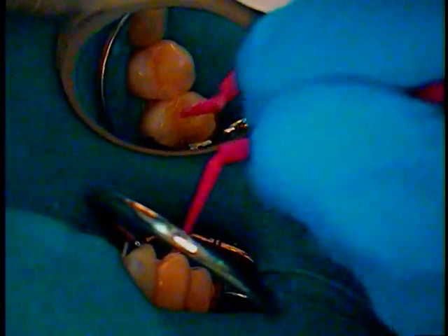Now we're going to introduce our bonding agent. So it's slightly wet, the dentin. In fact, what I'll do is I don't want to desiccate. I don't want any collagen fibers to collapse microscopically. So I just add a little bit of air. There's no pooling of water whatsoever. And in goes my bonding agent.